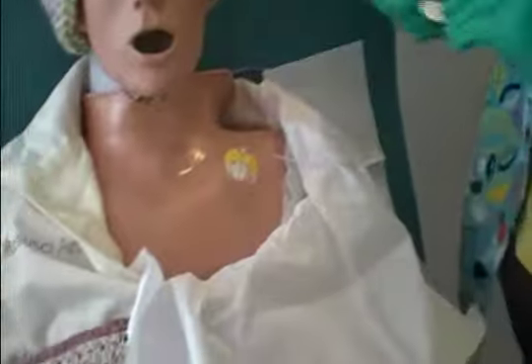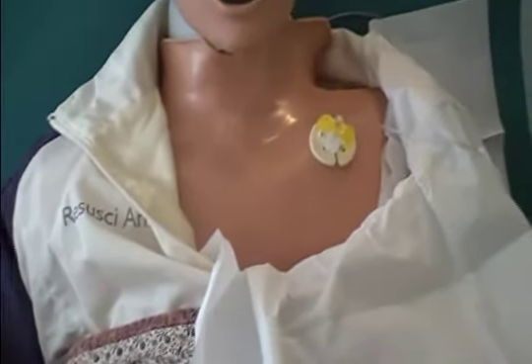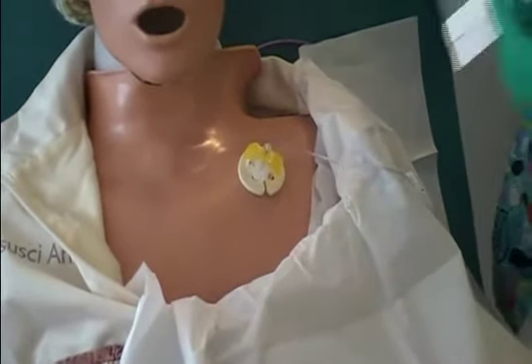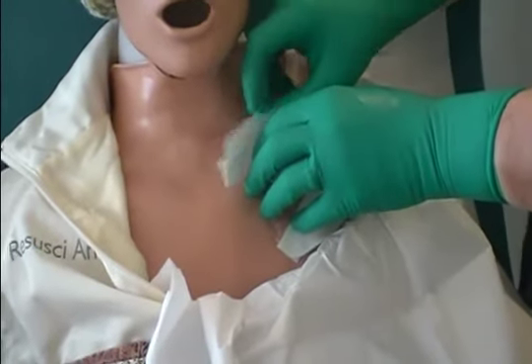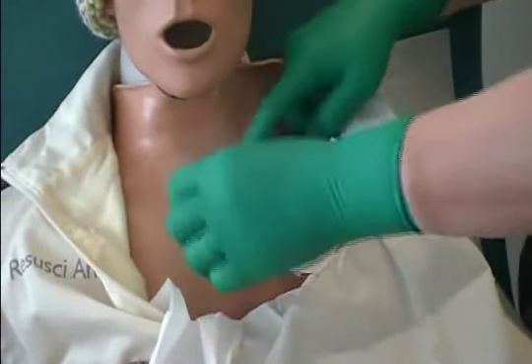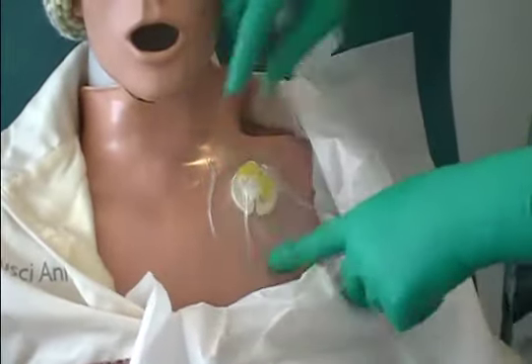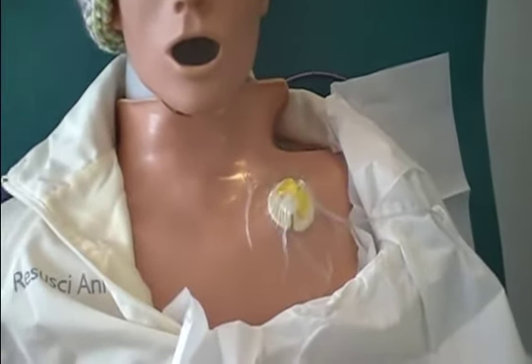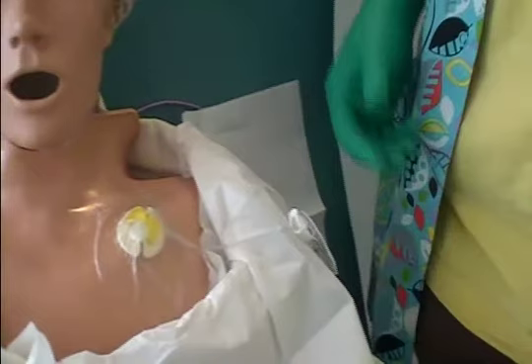I'm going to dress it before I get rid of my sterile field. I'm going to put the dressing over the middle there. Those darn things wrinkle up, so you have to be real careful when you're pulling them off to get them nice and flat, and sealed all the way around. Now I've got it dressed, so now I can take off my sterile glove.